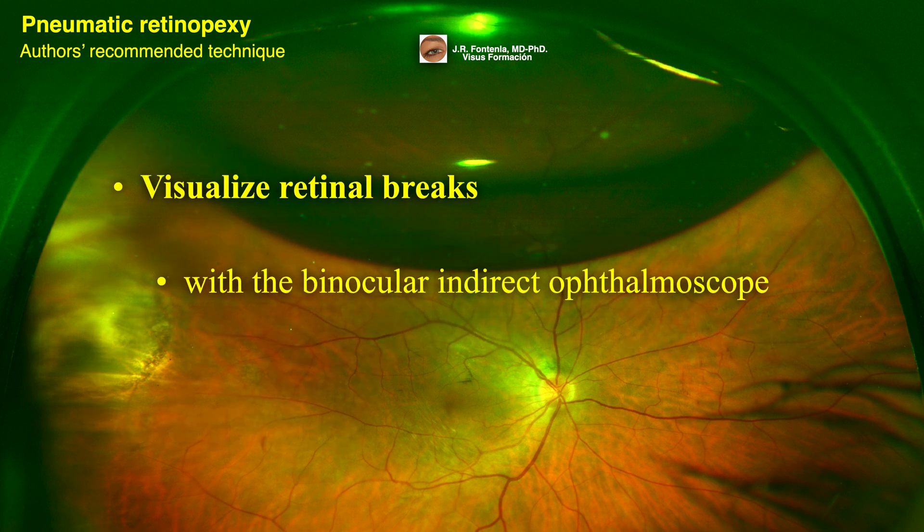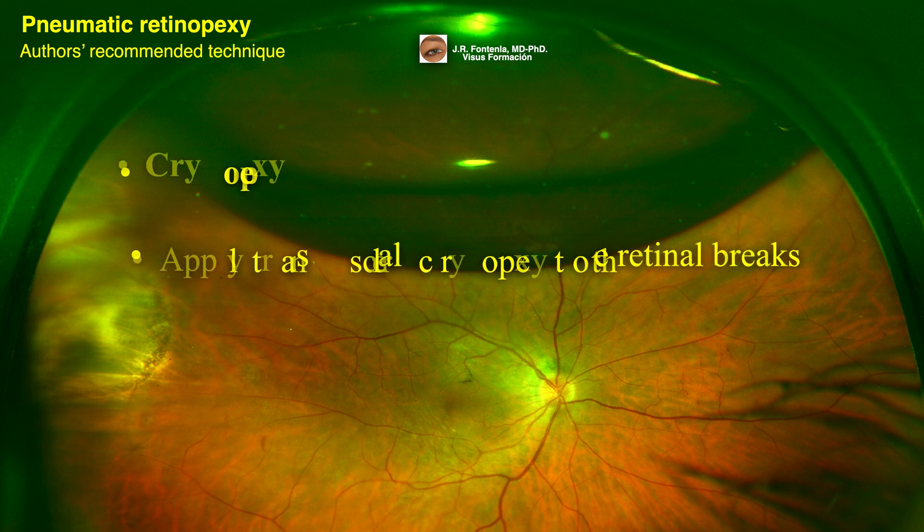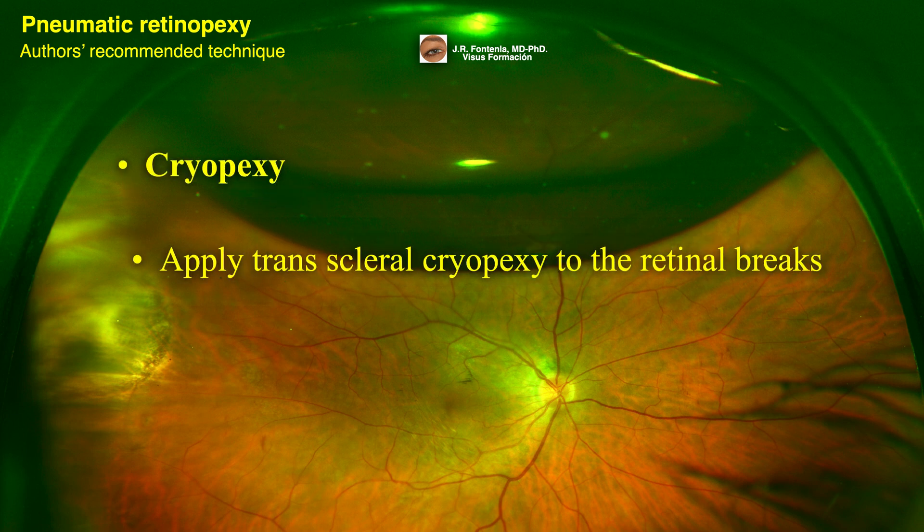Visualize retinal breaks with the binocular indirect ophthalmoscope. Apply transescleral cryopexy to the retinal breaks. Care should be taken to avoid excess cryotherapy to prevent possible release of retinal pigment epithelium cells and subsequent proliferative vitreoretinopathy formation.